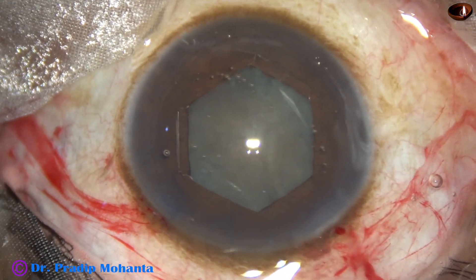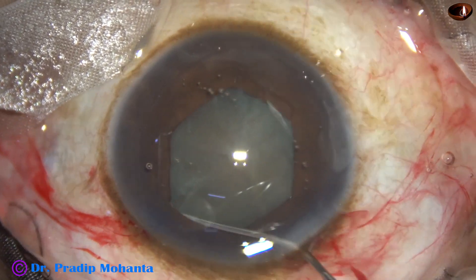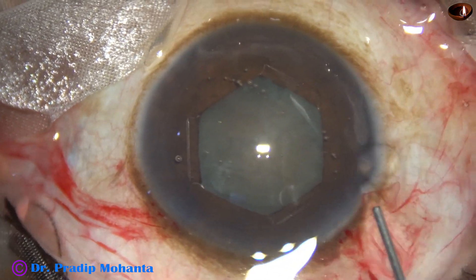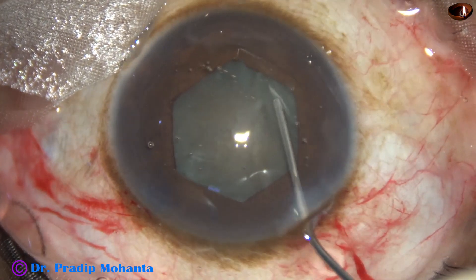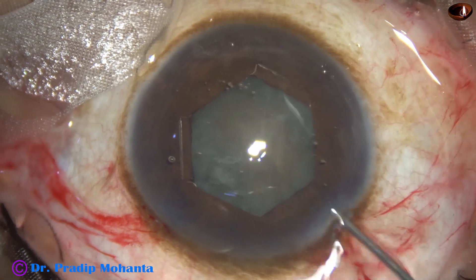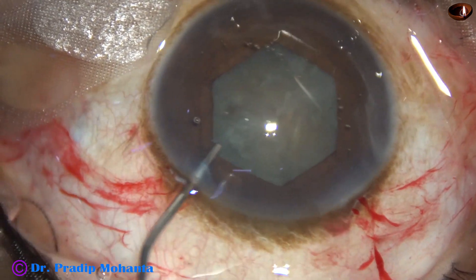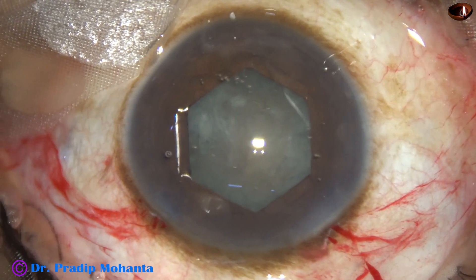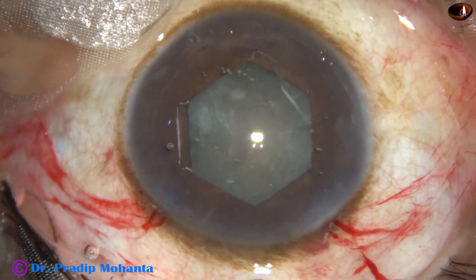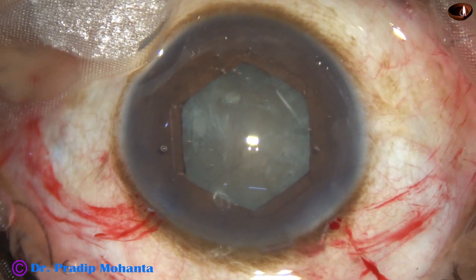Hydrodissection is now done. A very small amount of BSS is injected under the rhexis margin at multiple points. The nucleus is nudged and the nucleus rotates. Visco is again used to refill the anterior chamber.